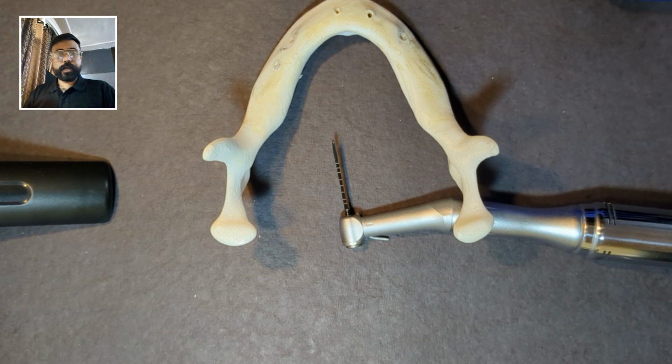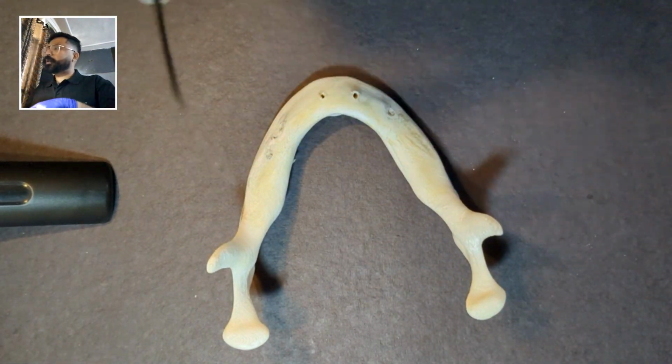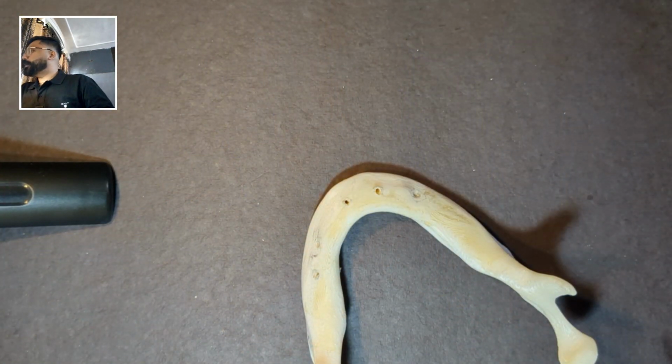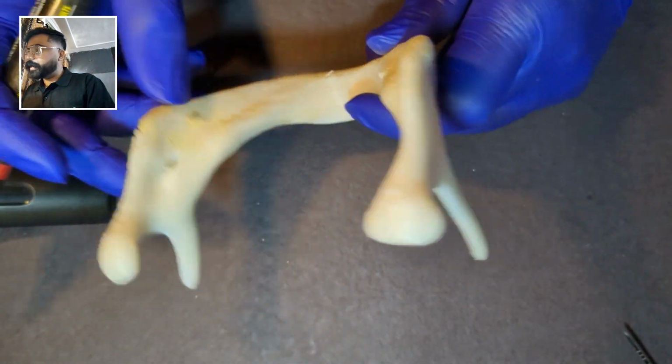Today we will be talking about lingual cortical engagement, which is a technique used in basal implantology. And for this, we will be taking help of this model right here. I hope everyone can see the model. So for learning lingual cortical engagement, first we will have to know about the mylohyoid ridge.